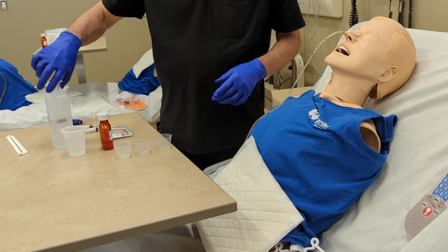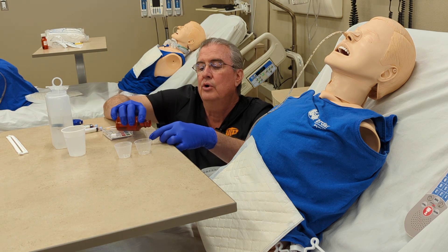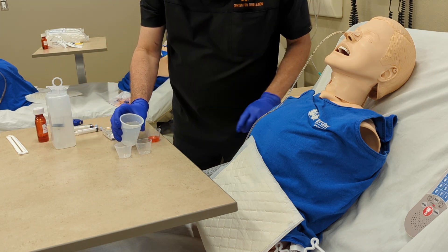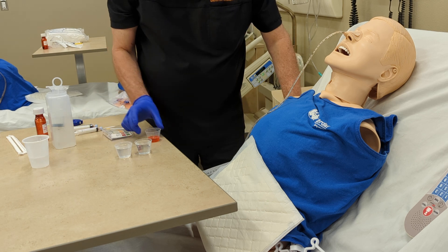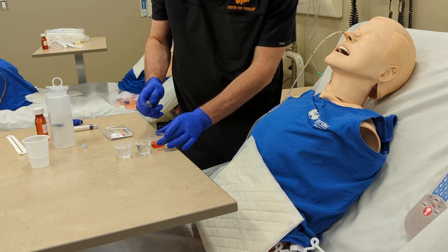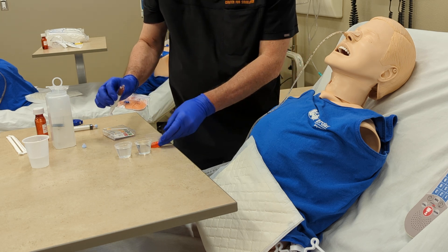We're going to go ahead and start administering the medication. This is 100 milligrams per ml, so we're going to give two ml's. I'm going to pour it in here and get it eye level to see where we're at — that's the two ml's. Then I'm going to get some water; we're going to go with 30 cc's of water to flush. I'm going to pull up to the two ml's with my syringe to verify the exact amount, and we're good there.